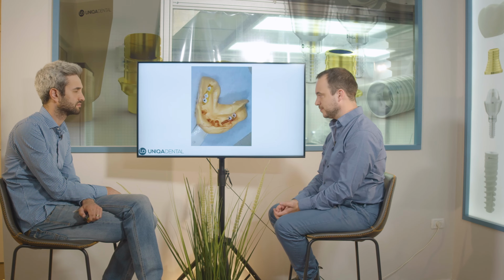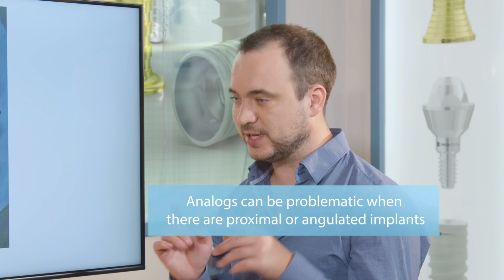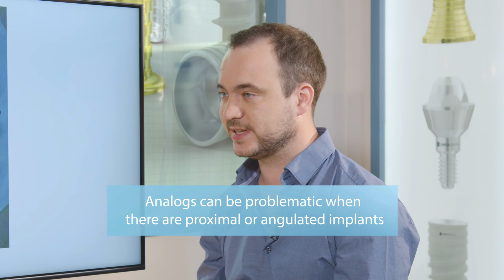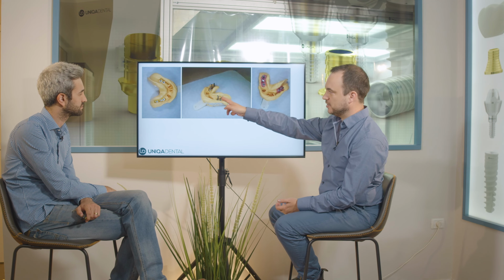When you put analogs, the most problematic part is when you have proximal implants and the angulation of the implants brings the tips of the implants toward one another. You need to cut the analog, because if you use a regular analog, you won't have place for the analog itself in the impression. So you can see what we did here is we took analogs where the tip of the analog is angulated, so the analogs don't touch one another. This way you have better fixation of the analog in the gypsum model.